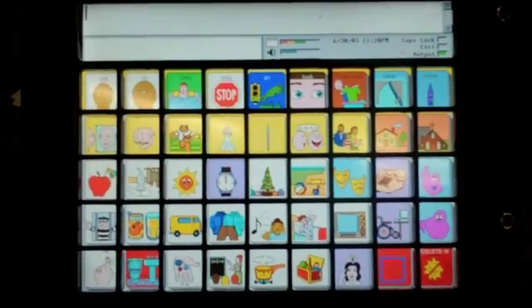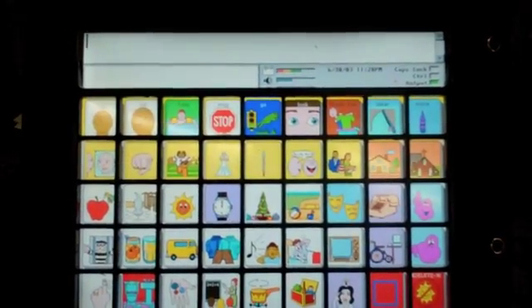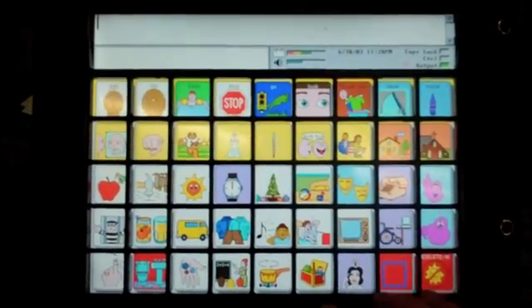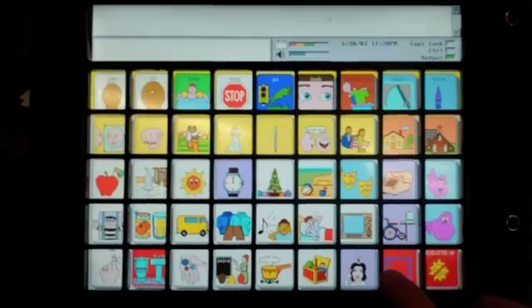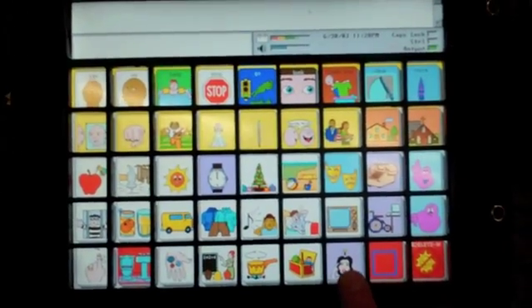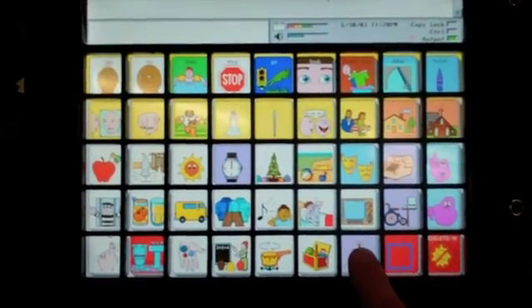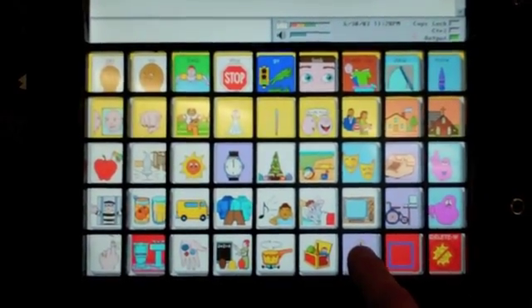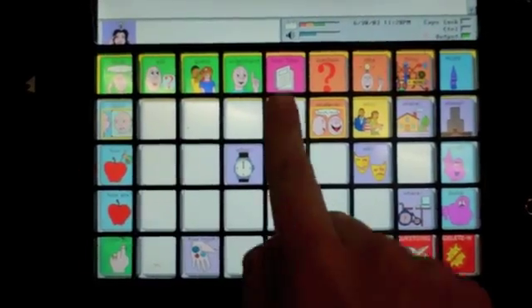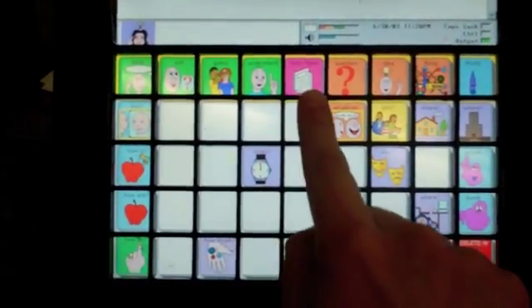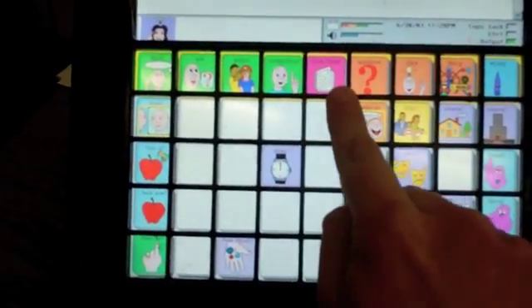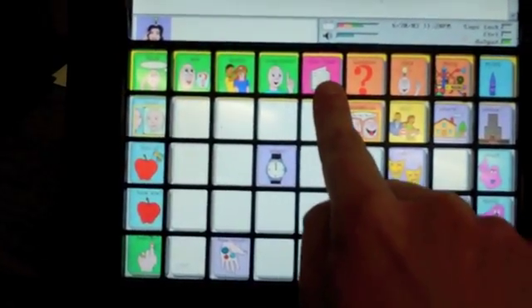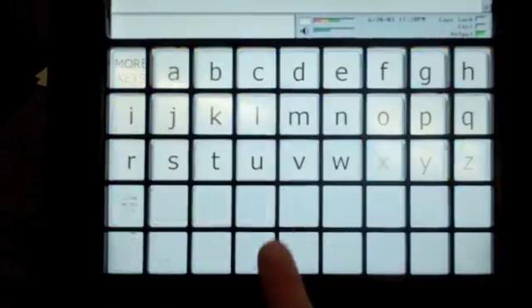Okay, so there are two different ways in which you can get to an icon tutor, which tells you how to find an icon if you don't know where the sequence to find it. You click down at the woman down here, this is the first way, and then this book right here, this purple color, which doesn't really show up in any of the other icons. You click icon tutor.